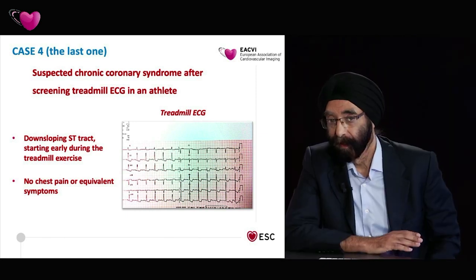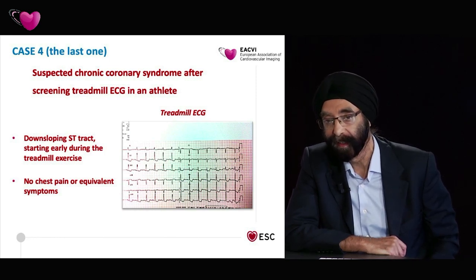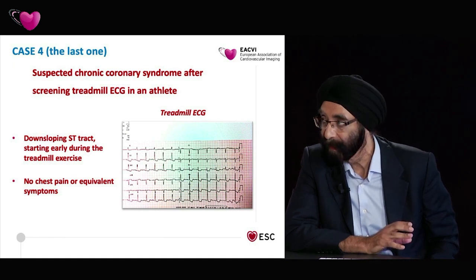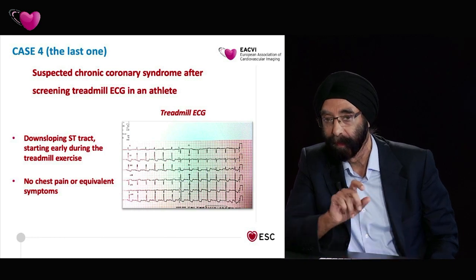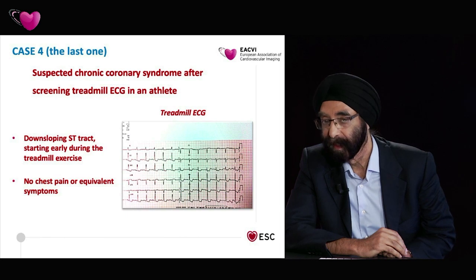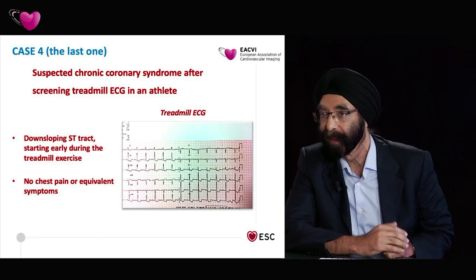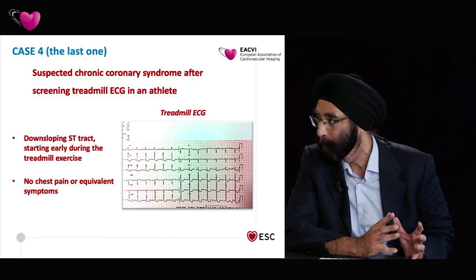Again, I think perfusion assessment is quite challenging. There are many pitfalls, and you can see many artifacts. So you really have to be very familiar with the machine settings, to be familiar with what is the right level of gain, the right level of contrast, and make sure there are no blooming artifacts. So it is quite a learning curve, and I would say possibly more than for normal stress echocardiography. Again, I don't have a specific number, but I think you need to do a lot in a short space of time.